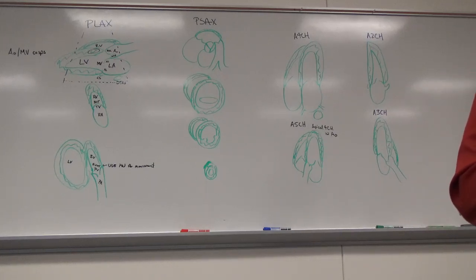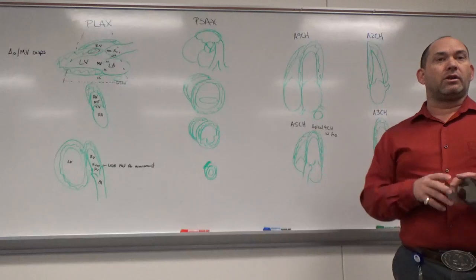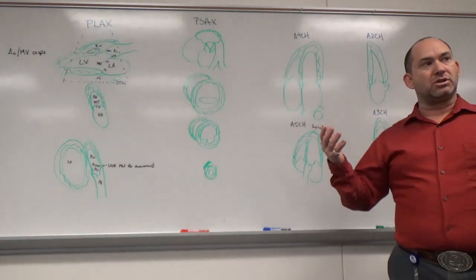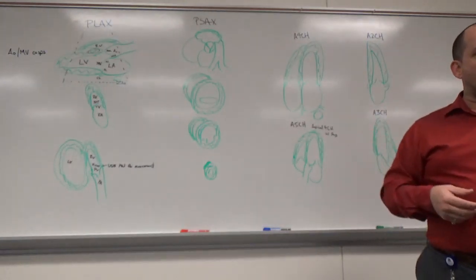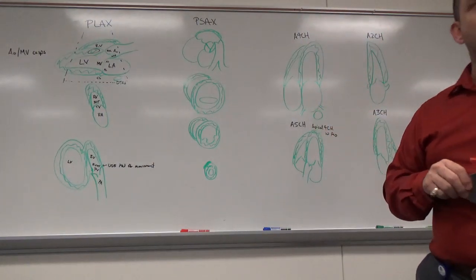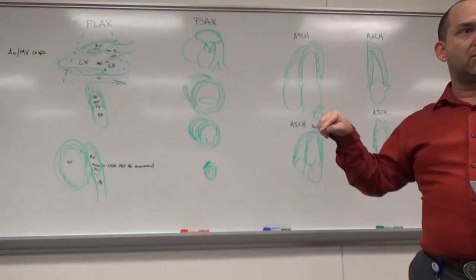Yeah, so in my quality control job, I'm not with the patient, I'm not with the sonographers while they're scanning. I'm looking at images just like a radiologist or cardiologist is. And I have to look at a lot of things in the image to notice that, because the techs don't always put down what was difficult and all the intricacies. We have to be able to look at it and understand that that was a tough patient. I can tell by what they did with the parameters of the physics of the system. All those numbers that are written on the side of your system tell me what you've been trying to do.